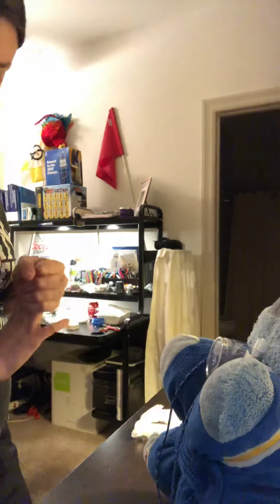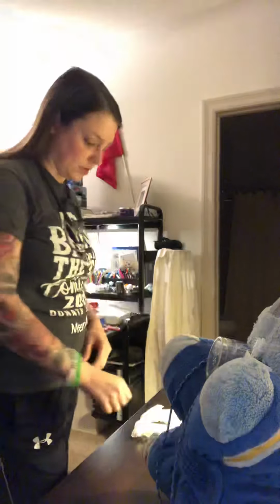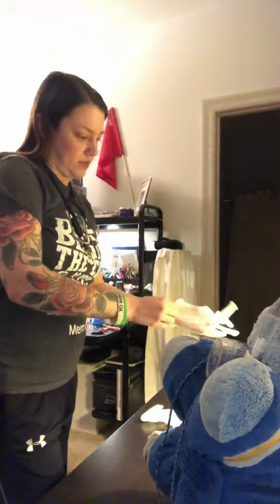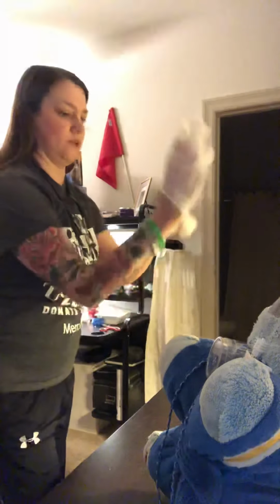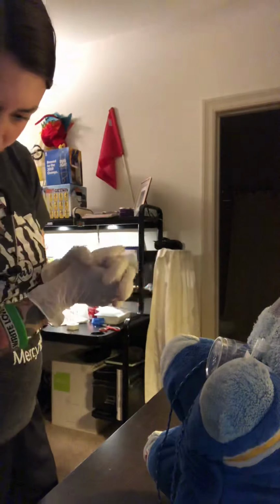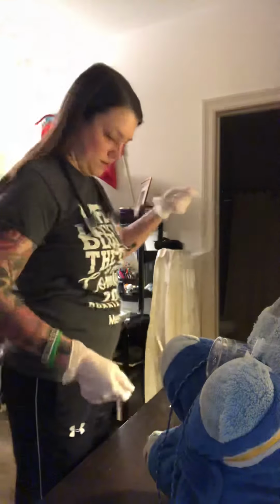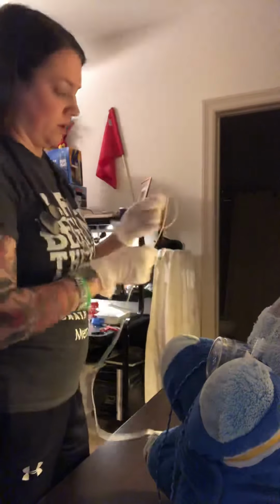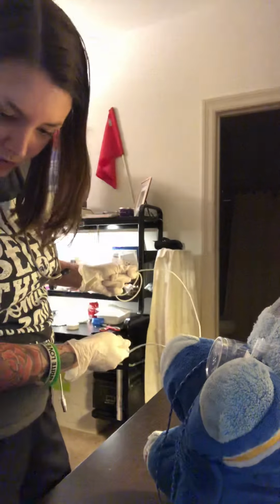Then I'll make sure I go ahead and prepare my supplies. I would put on sterile gloves, but I don't actually have a pair of sterile gloves today, so I'm just going to put my gloves on here. Okay, gloves are on. So now I'm going to go ahead and do my catheter here. On my dominant hand, I would coil it around. It's a little long, so I'm just going to do a little bit like that video showed me.